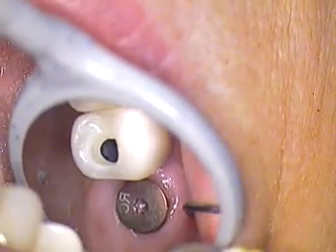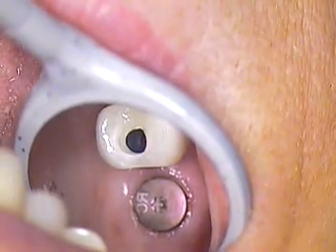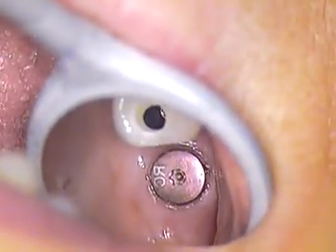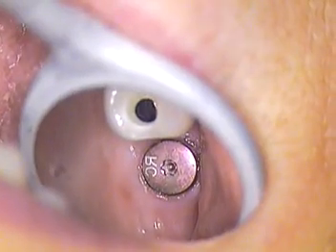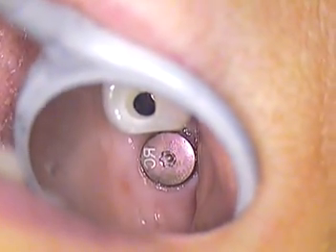I think she's got a lot of keratinized tissue all the way around, so you need that. For the layperson out there, you need to have that gum tissue, because tissue is definitely the issue. You've got to have enough coverage. Otherwise, you start to see the body of the implant later on and it won't look very good. Plus it's not healthy. So you've got to have good tissue.